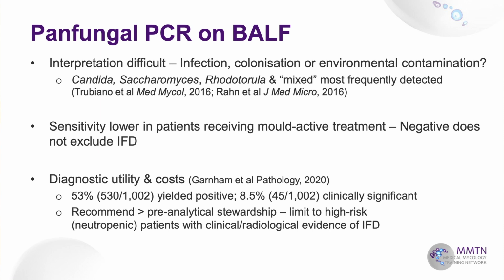As I said, pan-fungal PCR on BAL fluid, it's the bane of my life. 50% of the samples, or most of the samples, are going to be positive with things like Candida, Saccharomyces and Rhodotorula.